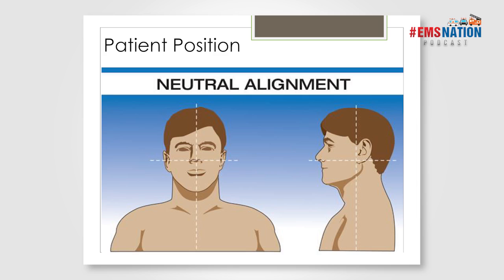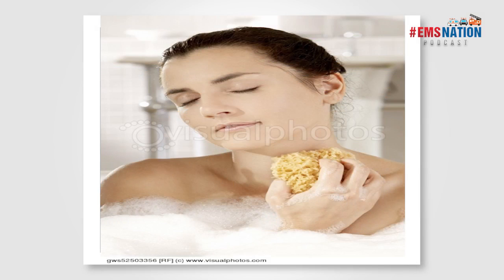We want to clean the patient. This is not cleaning the patient. What you want to do is provide a good cleanse with povidone iodine or an alcohol swab in the ideal state. Think 30 seconds, scrub the hub. We've all talked about that.